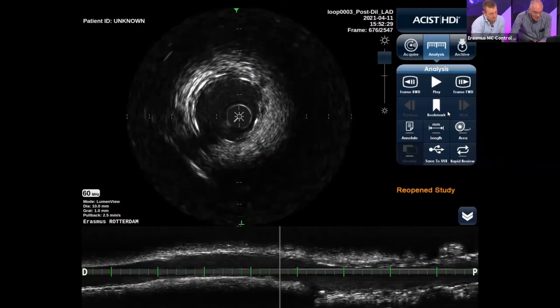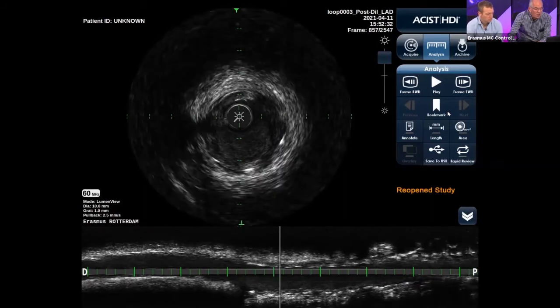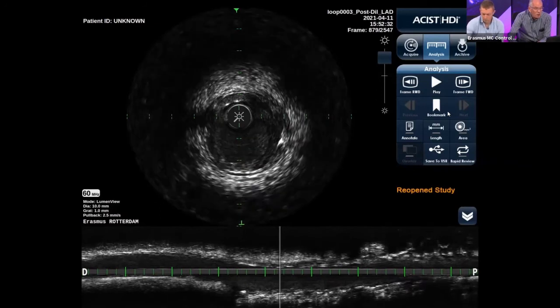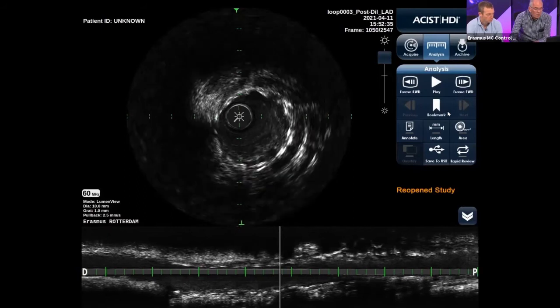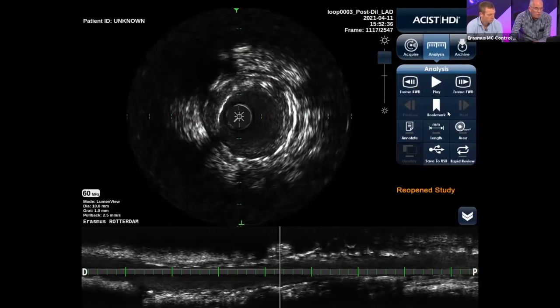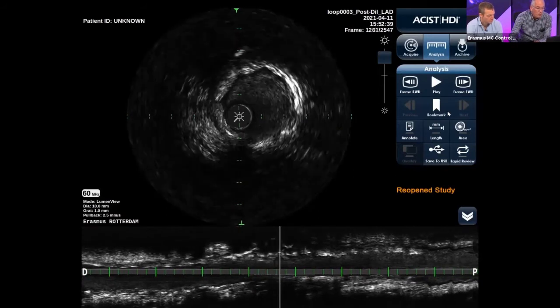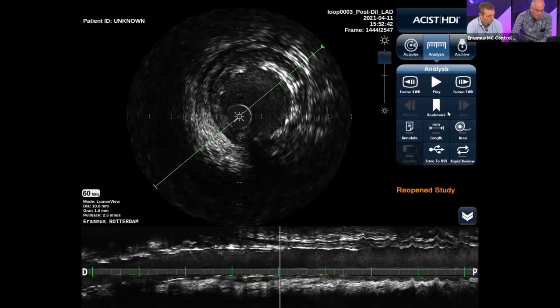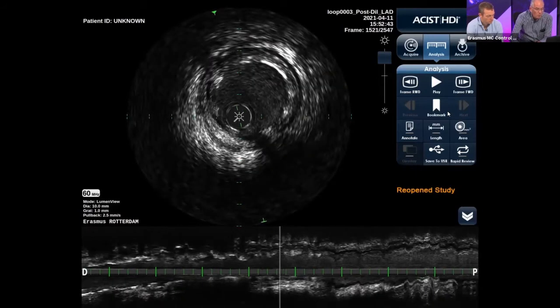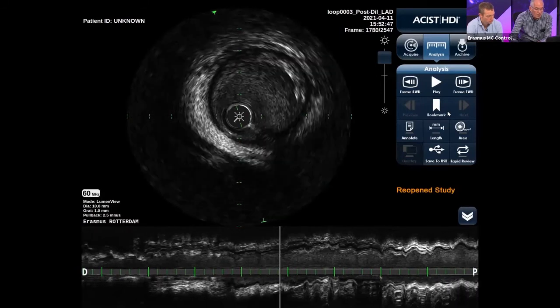Yeah. And so if we move to the stent, then we see that there is still some organized thrombus visible at the wall, but now we have a larger lumen, it's more compressed. You'll never remove it completely, but now we have a good lumen in the stent, and you can appreciate it also by the darker aspect of the lumen, the speckling in the lumen, indicating better flow. And that you will appreciate also on the result on the angiogram.